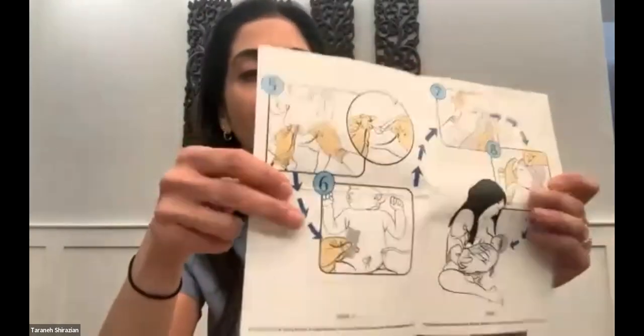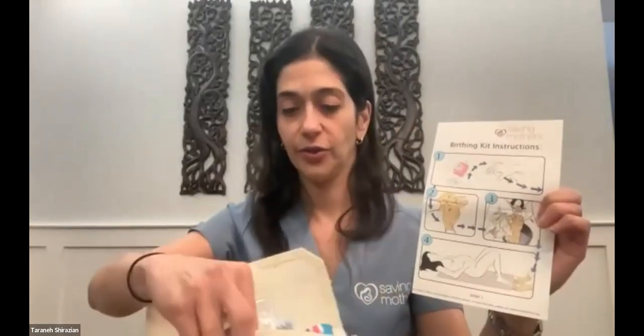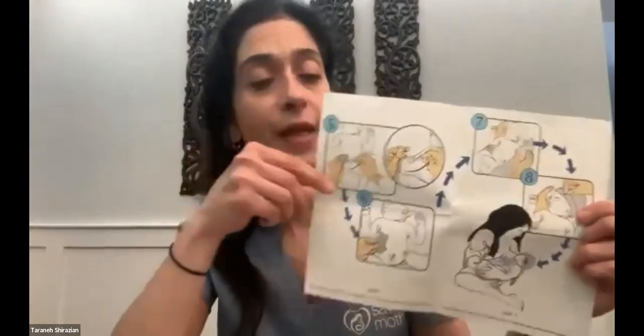So you put on the gloves. If you do have clean water, there's a small bar of soap. You can wash the perineum as well. You put the mat under the mother, which is also in here. It's just a clean rubber mat, just so she doesn't deliver on a dirt floor.